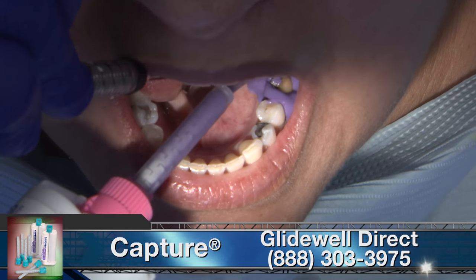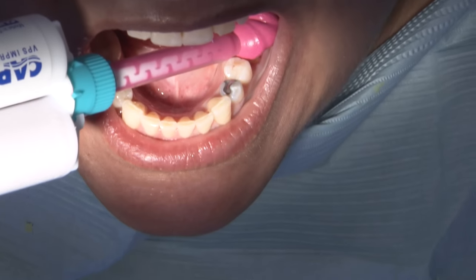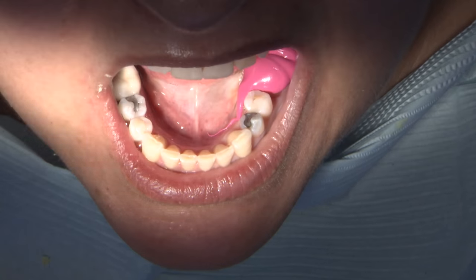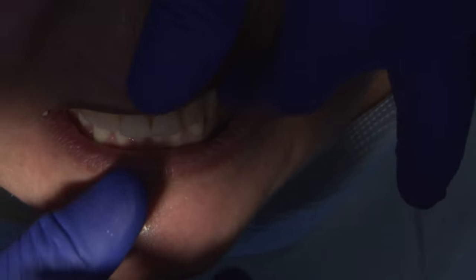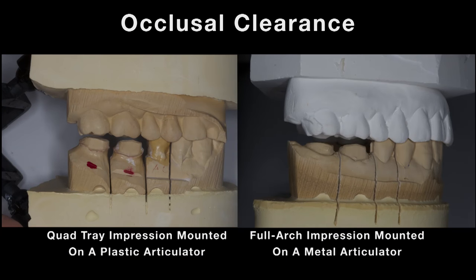Because here we have no occlusal stop distal to the prepped tooth, it is important to provide the lab with a full arch impression along with a proper bite registration. This will minimize occlusal errors without running into the risk of having restorations low in occlusion.